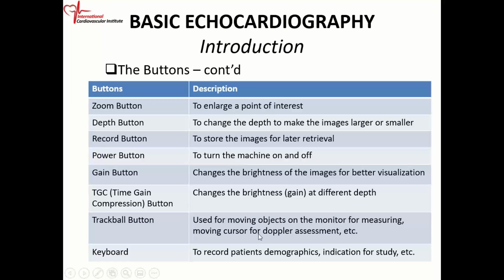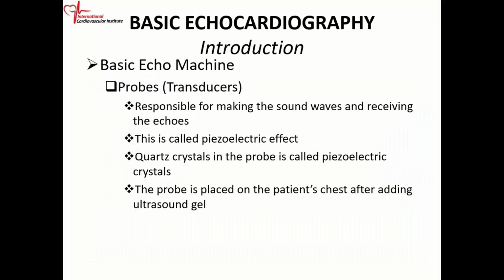Trackball, we use a trackball for moving objects on the monitor, for measuring, the cursor for the Doppler. Once you start using these things, then it's second nature. You don't have to memorize this. And then the keyboard, demographic indication for the study, all that sort of stuff.